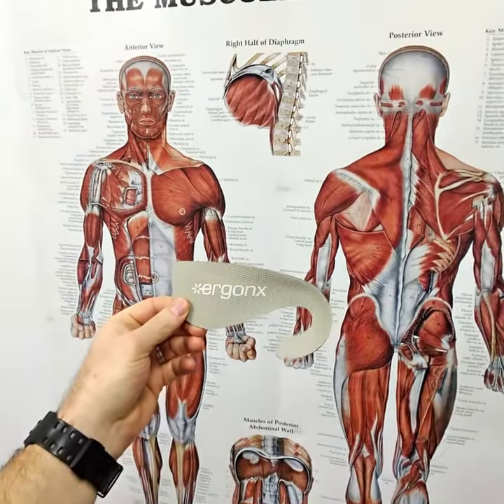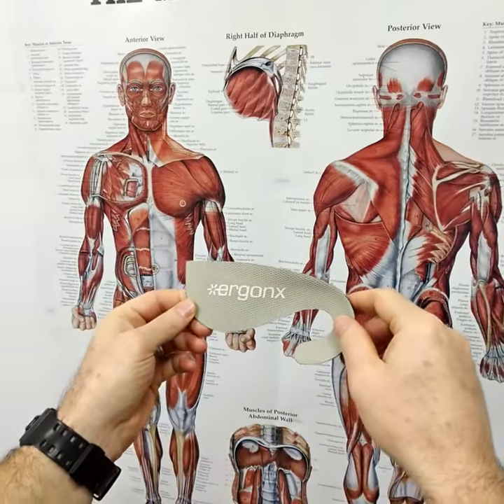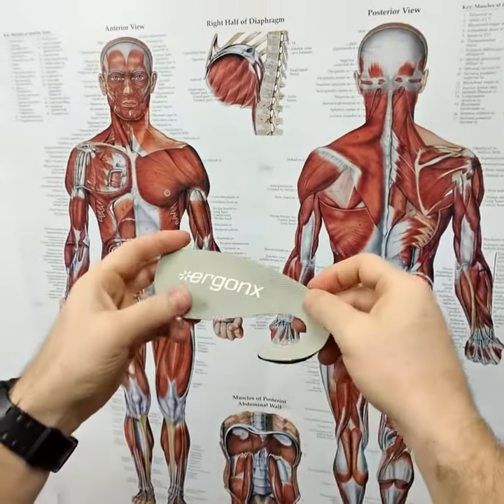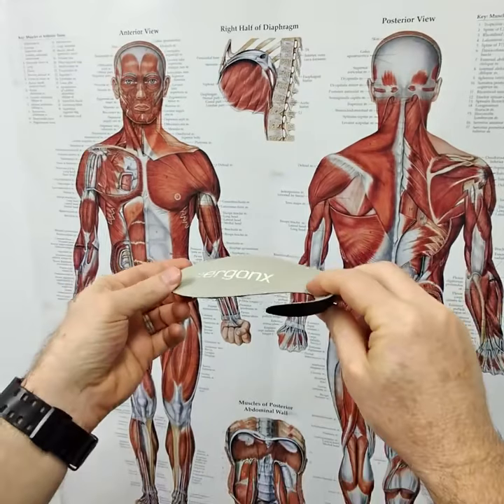Hi guys, today we're looking at the Ergonx Slimline — that's the hookback orthotic inner sole. This is the orthotic inner sole we use for people with heel pain, plantar fasciitis, heel spurs, and arch pain who are wearing fashion shoes that can't fit a regular orthotic.